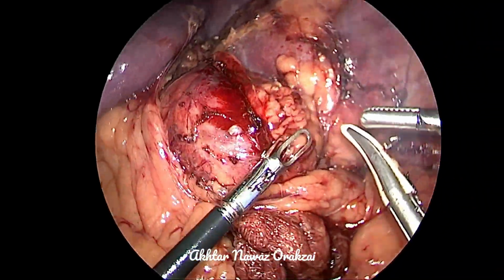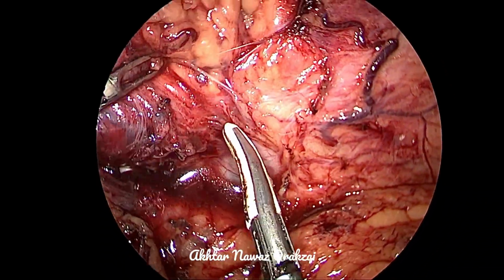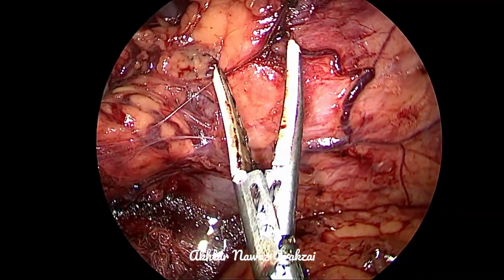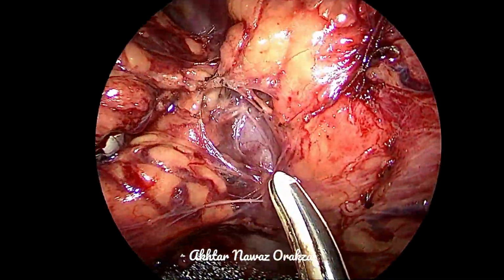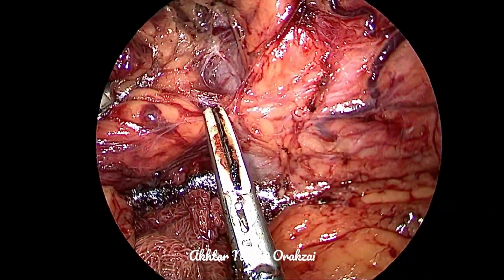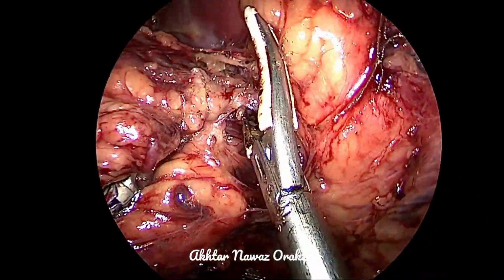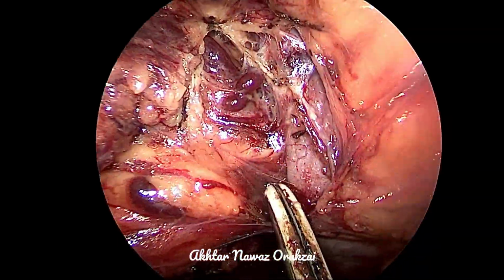kidney. Remember, there is a branch which is coming from the upper polar vessel of the renal artery. So the renal artery is lying nearby. So dissecting this portion of the adrenal gland needs to be very careful, because there will be a renal vein and especially the renal artery. An injury of the renal artery is not desired at all, because this will lead to compromise of blood supply to the kidney, which is not the culprit in this situation at all.